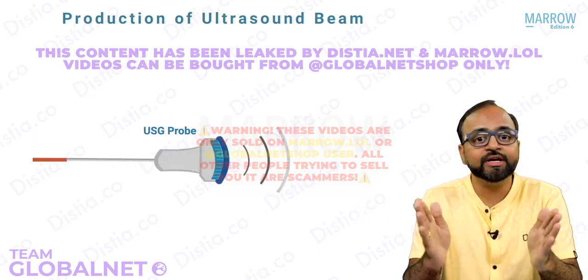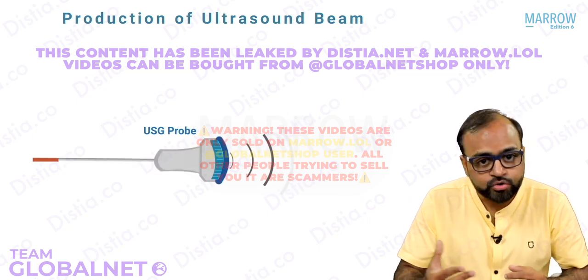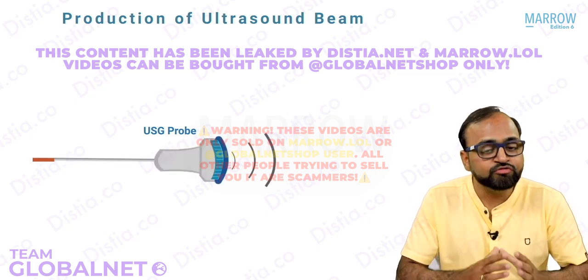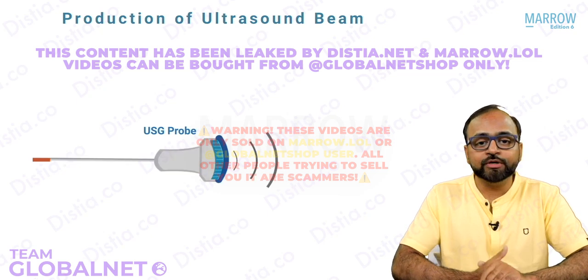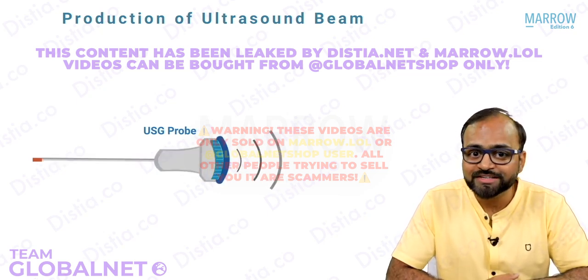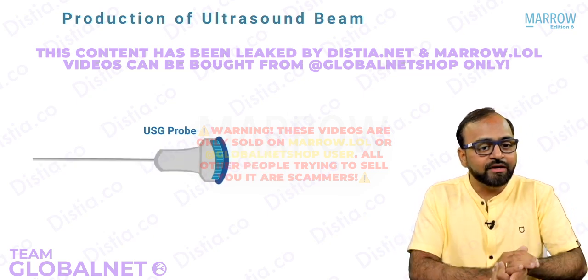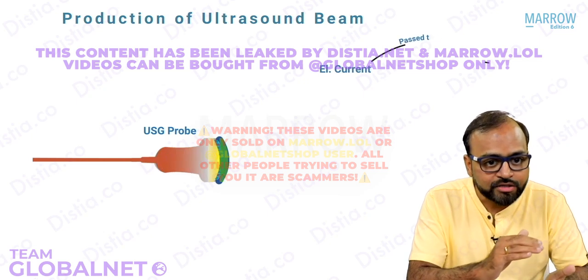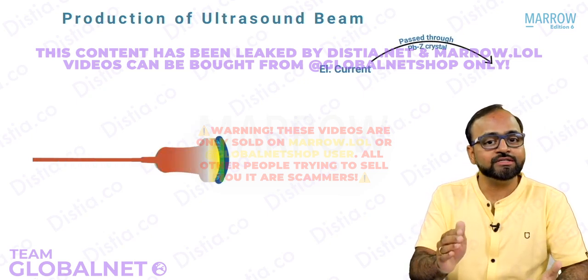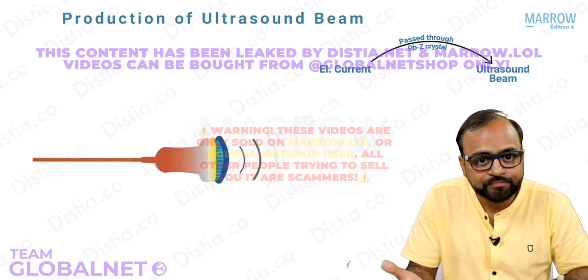Because the crystal is vibrating at a frequency of more than 20,000 hertz, the mechanical waves are also going to have a frequency of more than 20,000 hertz. Can you tell me what mechanical waves with a frequency more than 20,000 hertz are called? They are called ultrasound. So what we have seen here is that when an electric current is passed through lead zirconate crystals, they vibrate and the result is production of an ultrasound beam, isn't it?